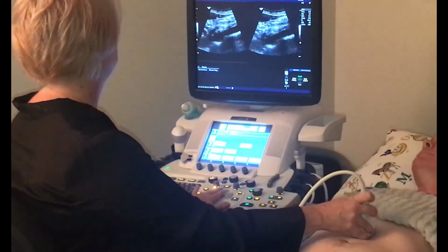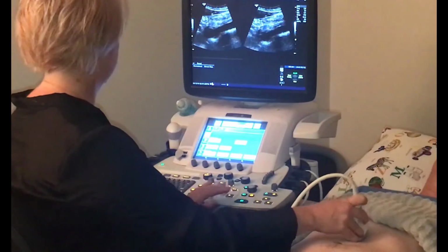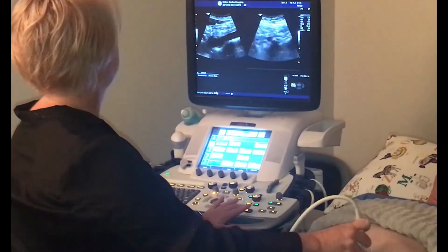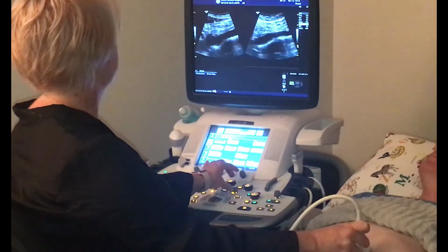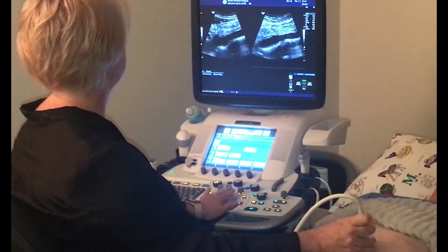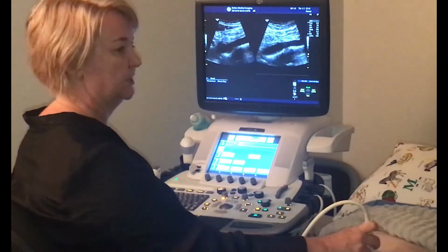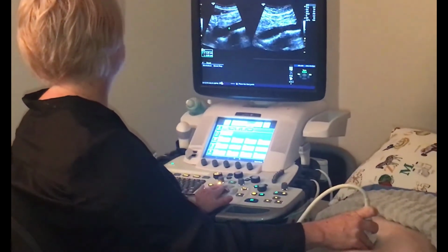We will then slide our probe back superiorly or towards the head, and that's where we'll actually take our measurement of the aorta, and we take this within around 2 centimetres of the SMA. So this is why it's very important to know the branches. We like to take it in a uniform spot every time to check the size. And we do this to prove that it's within normal limits.